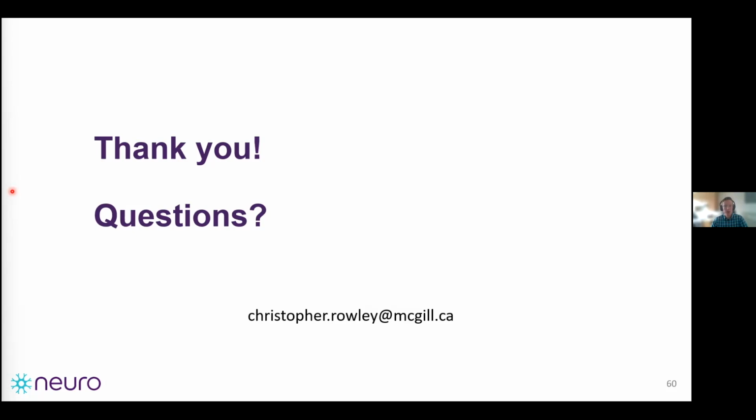Yes, so the comparison between 3T and 7T, that was the MP2RAGE. Jose Marques already has code out on his GitHub to do that calculation yourself in MATLAB. It's pretty straightforward. All you have to do is input a B1 map into the function. If anyone's looking to do that, you can contact me. I've also made an additional function to get B1 corrected M0 maps if you're planning to do an MT-SAT calculation. But at least for that, it's pretty straightforward.